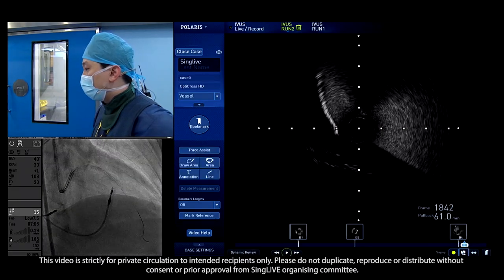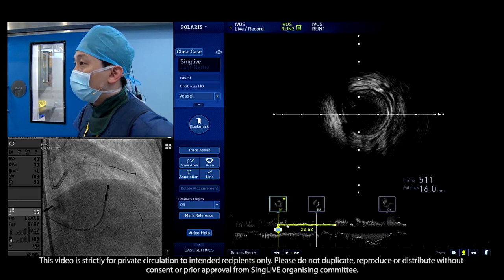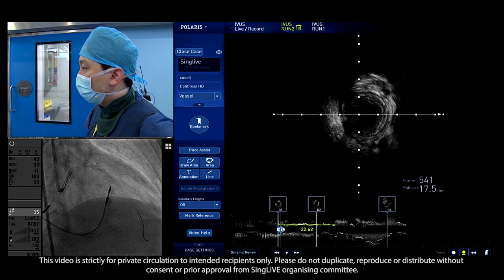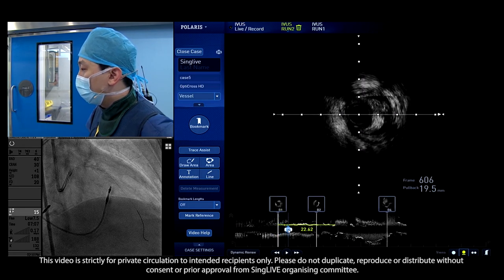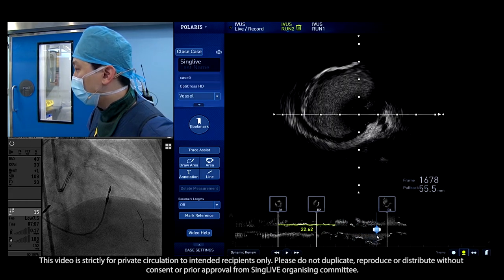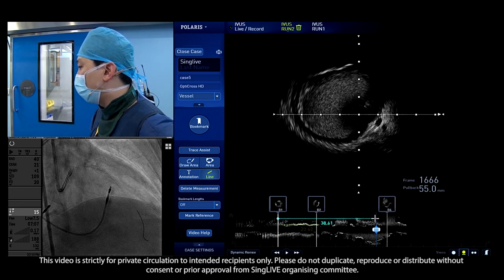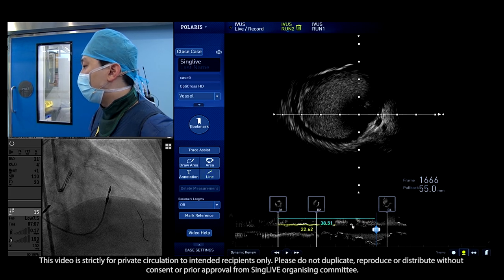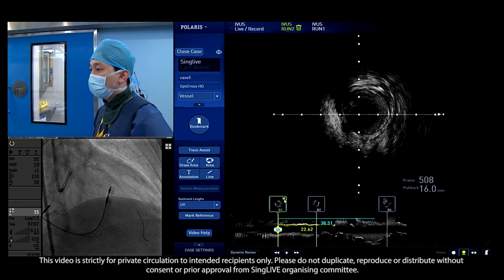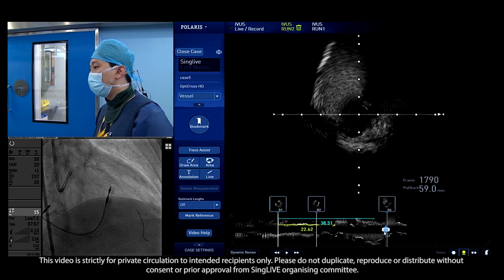So we discussed a lot about the stenting strategy with the IVUS findings: whether to put the stent where, and which stent to implant. One strategy was to put a stent here to cross the diagonal bifurcation and left main bifurcation to the left main shaft. Then it could be covered with a 38 stent, but the problem was the size discrepancy. If we put this stent, we have to put a 2.5 or 2.75 stent for the mid LAD, but the left main size is 4.0 or more.